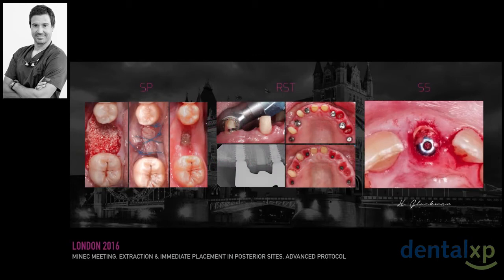Today, preserving the ridge has become a must in implant dentistry, and many techniques have been published with very predictable results, either at pontic sites or for implant site development, such as the root submergence technique, where we submerge the roots in order to preserve the volumes of the ridge, preserving the bundle bone around the teeth; the socket shield, where we actually preserve the buccal part of the tooth in order to preserve the buccal plate; or the classical socket preservation with bone graft material.